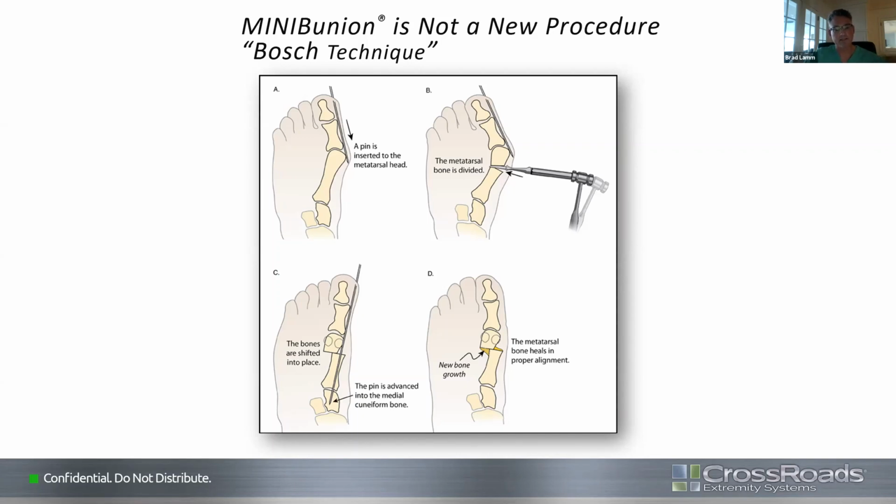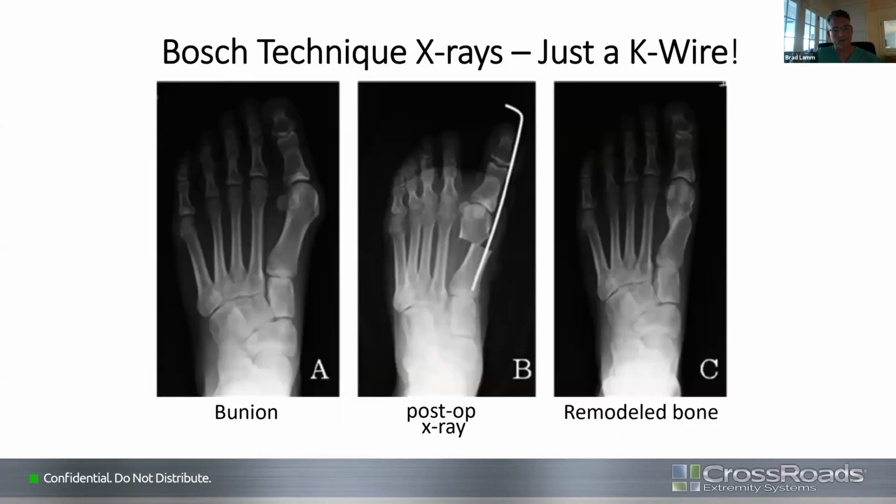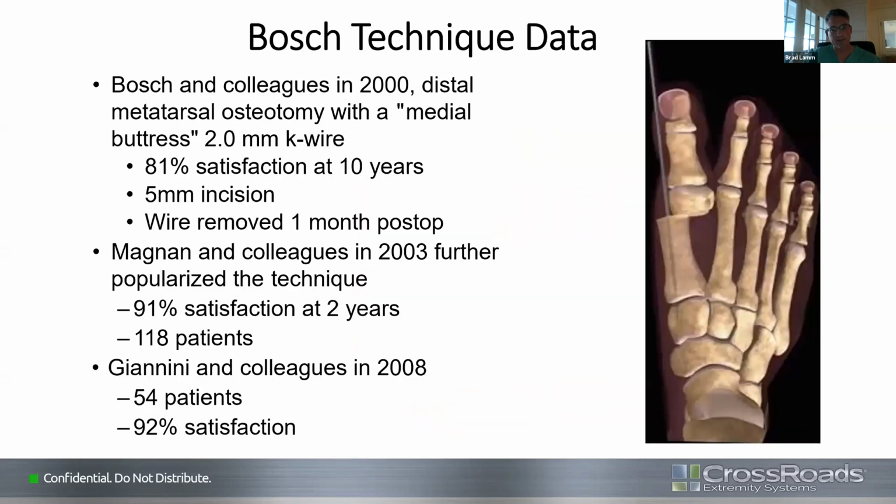So this is relative stability, not really ultimate stability, but you do get bone growth, and you have a small incision. And this worked very well, as you can see here, just a case example of this technique. You see the remodeled bone, even though you see 80%, 90% translation of the osteotomy, the periosteal envelope was still intact due to the minimally invasive nature, and you see remodeling on that lateral side post-operatively.